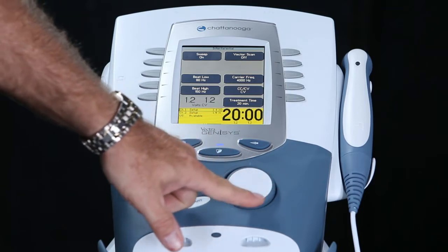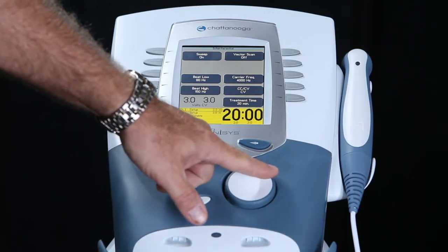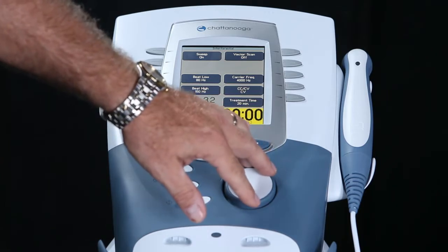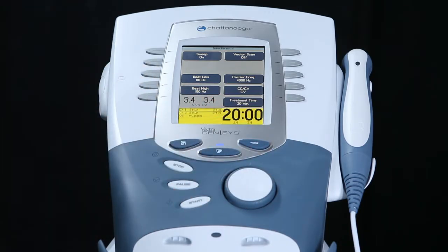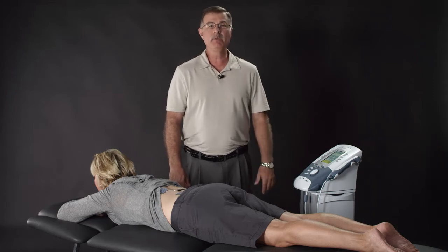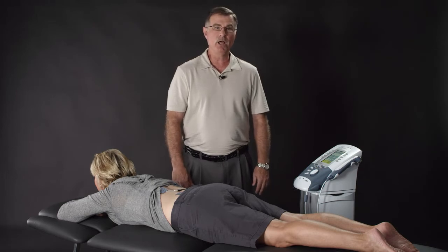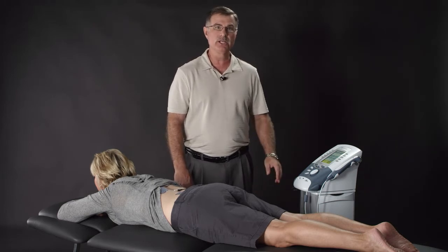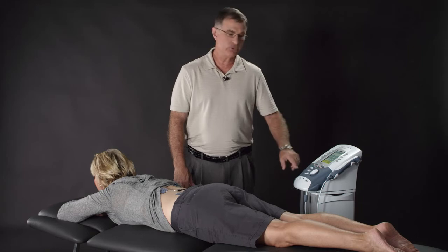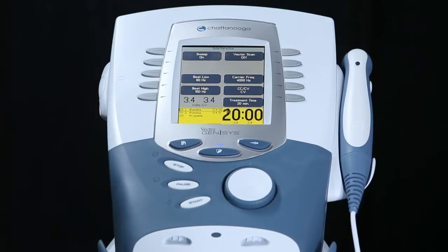We will turn up the amplitude until the patient feels the current. Once the patient feels the current, we will note that spot and then just turn it up slightly more. For a gate theory protocol, we want a strong sensory feel. For an opiate release protocol, we would want a slight motor twitch. For a nerve block protocol, again, we would want a strong sensory feel. Once we have that strong sensory feel, we will press the start key and the treatment begins.